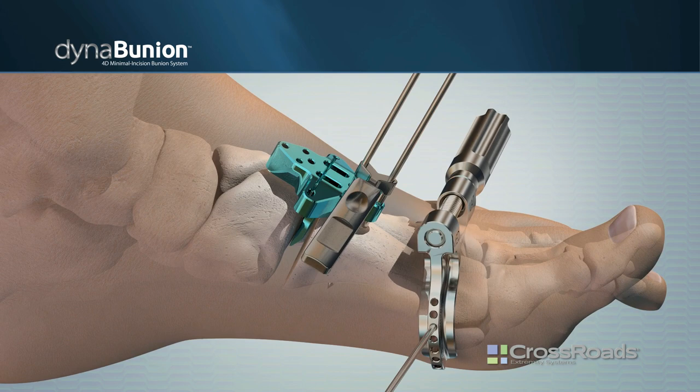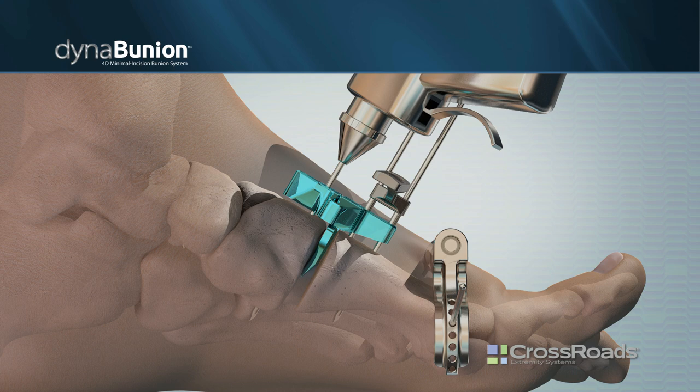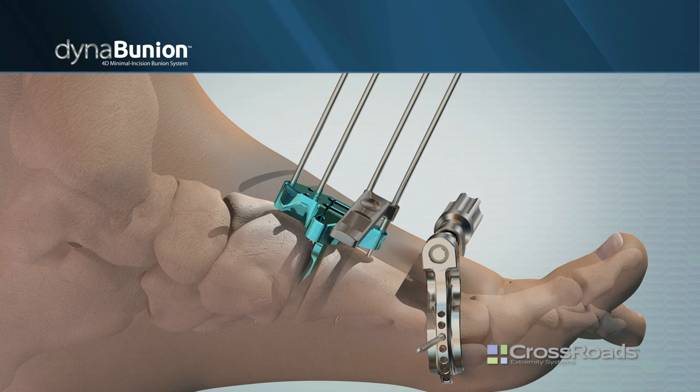While still engaging the windlass, place a short 2 mm wire into the second most proximal hole. Place the long 2 mm wire into the most proximal hole. Utilize one of the provided 40 mm saw blades to complete the cuneiform cut.